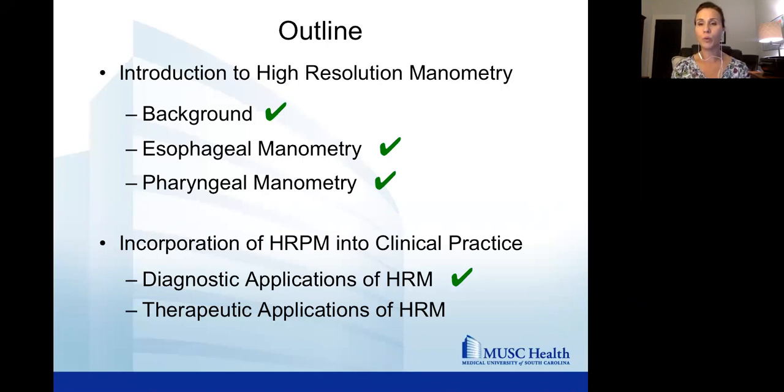There might be where we do more. So I don't want to give the impression that we're using high resolution manometry in every single patient. And I don't think there's an indication for it in every patient. We use it when we need something as an adjuvant to help us make a better diagnostic plan or diagnostic evaluation and also a better therapeutic plan.